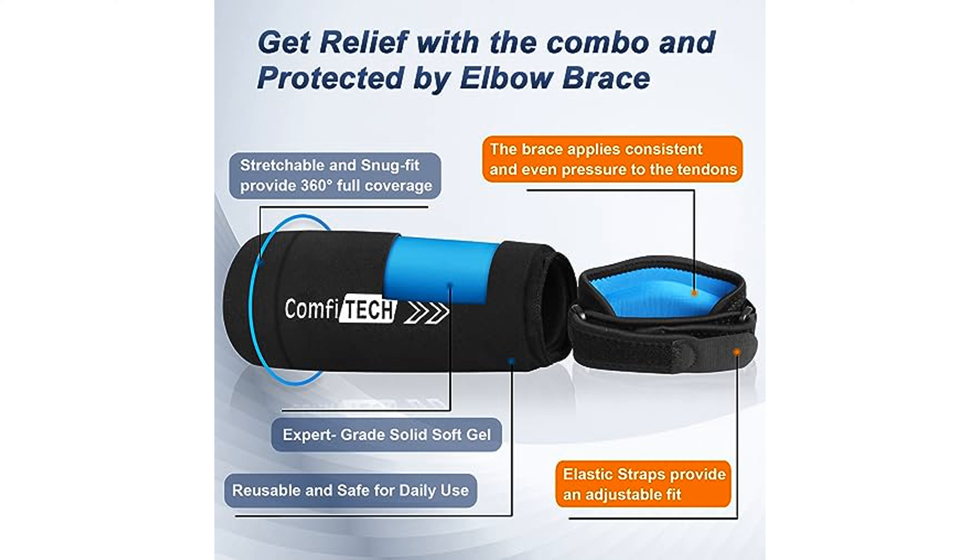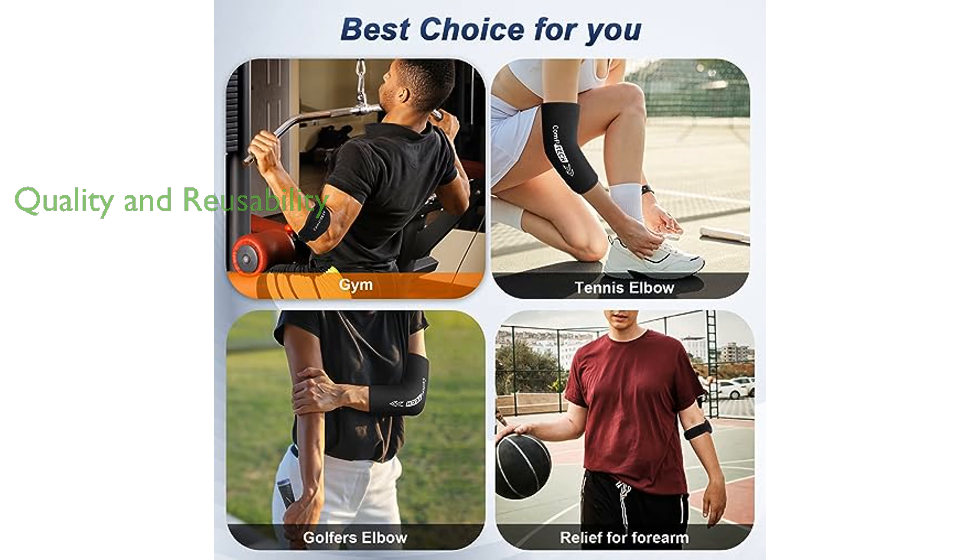The tennis elbow band is adjustable with a hook and loop strap, ensuring a secure fit and full mobility throughout the day. The tennis elbow ice pack sleeve is filled with expert-grade soft-solid gel for extensive reusability, and the elbow tendonitis brace is made with sturdy stitching, an EVA cushion, and breathable fabric for long-term durability and comfort.